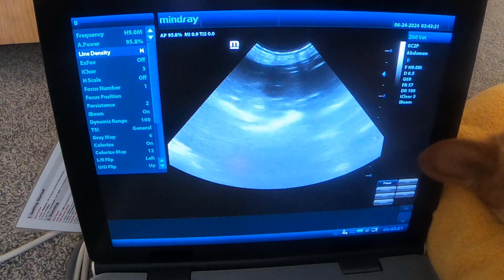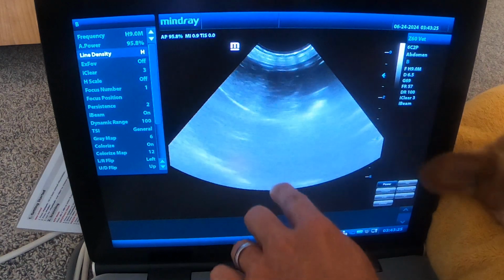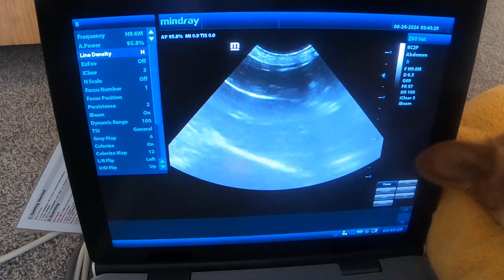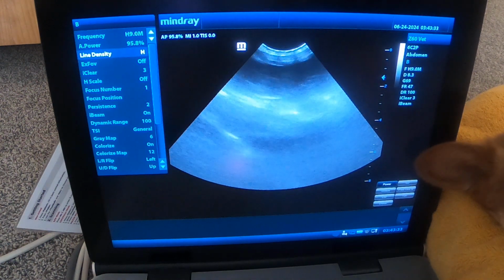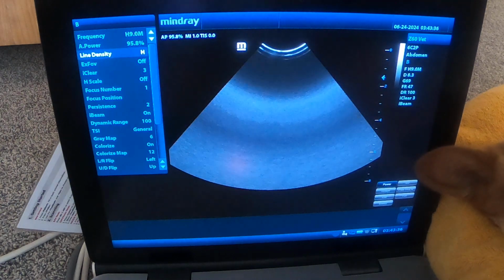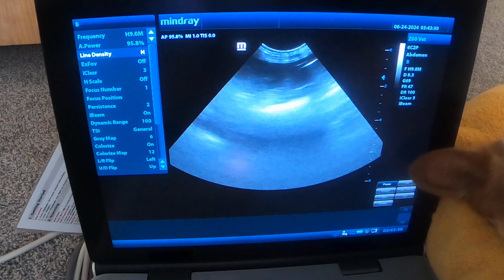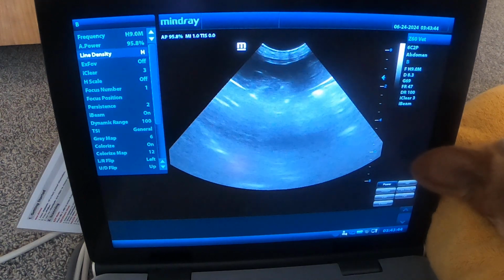Perfect. So we got spleen, stomach coming in right here, that gas-filled area. And then just cranial to that is going to be liver. Drop my depth down a little bit so you can see more of the liver. Get a good view, coming more towards midline and to the right. Oop, he's just tightening his little belly up a little bit on me. There we go.